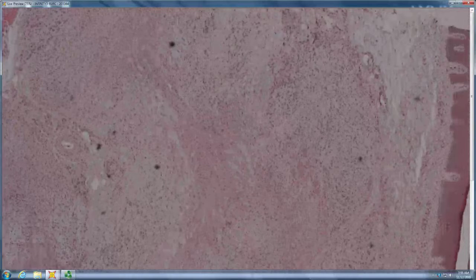And some red X's, sort of. Some red X's, which would make you think of, especially with necrotic or neutrophil debris in it, like a xanthogranuloma. Like what kind of xanthogranuloma? A necrobiotic one. Necrobiotic xanthogranuloma with all the red X's. So what would you want to look for? Probably paraprotein. That's right.